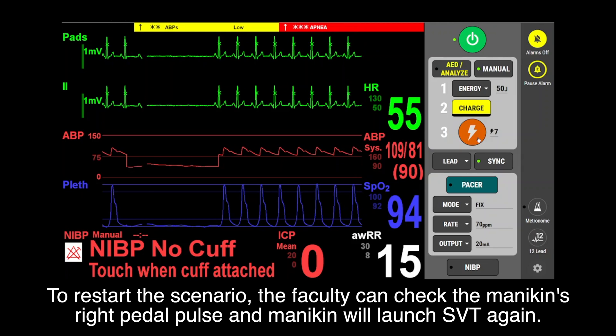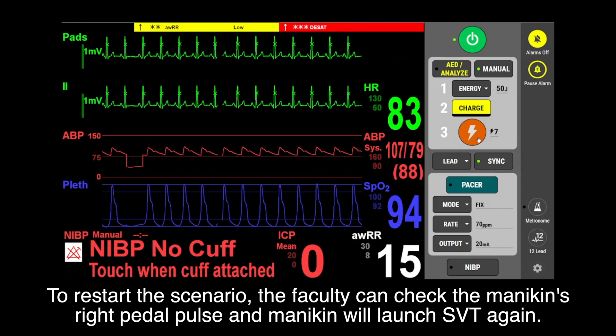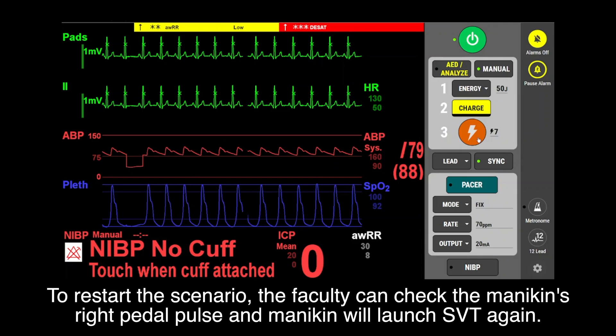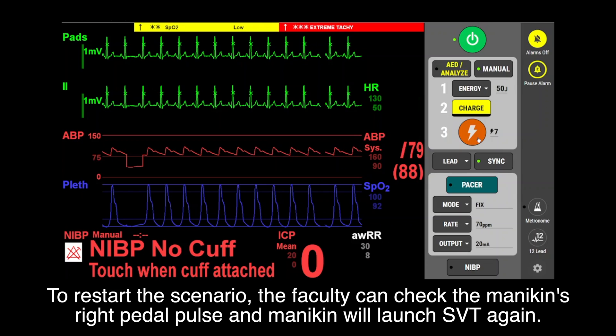To restart the scenario, the faculty can check the mannequin's right pedal pulse and manikin will launch SVT again.